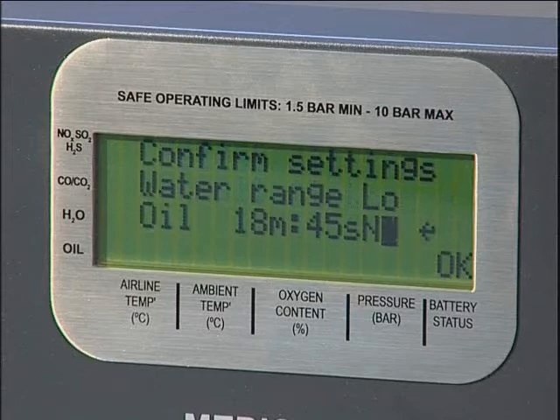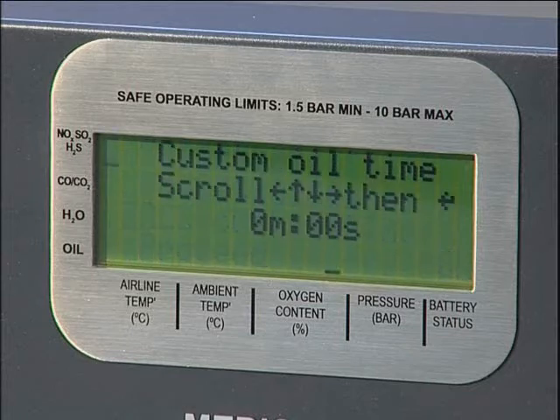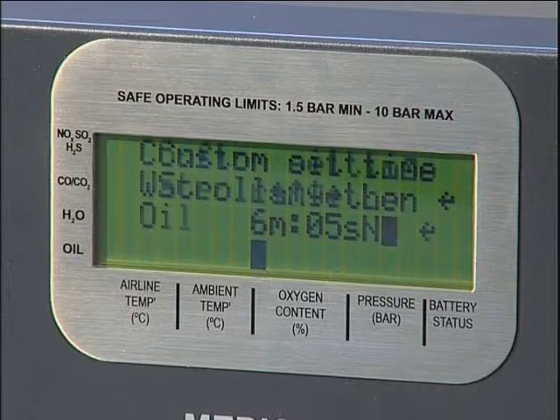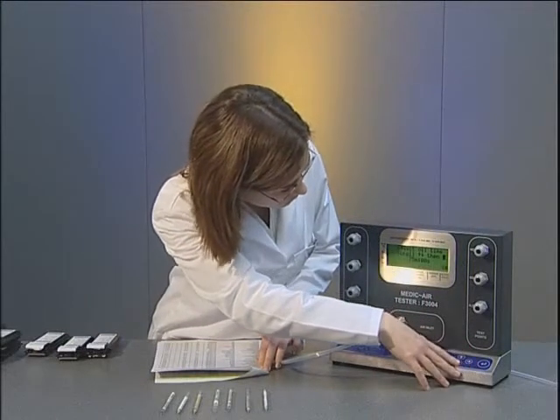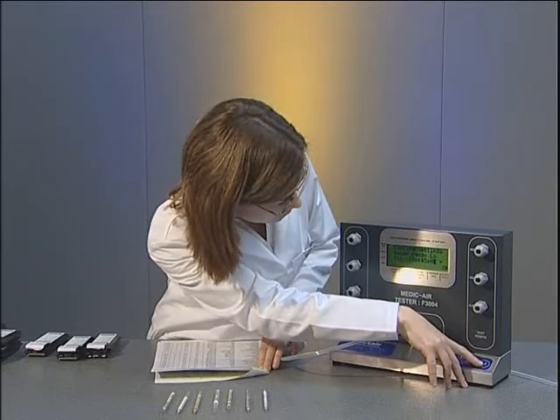If the oil being used does not correspond to a preset time, the unit has the capability to be programmed with a custom time. This will be stored with the presets for future tests and will remain in the memory until a new custom time is entered. If an oil time is not selected, the unit will default to 75 minutes. This setting should be used if the type of compressor oil potentially in the system is not known or there's a risk of cross-contamination from other oils.